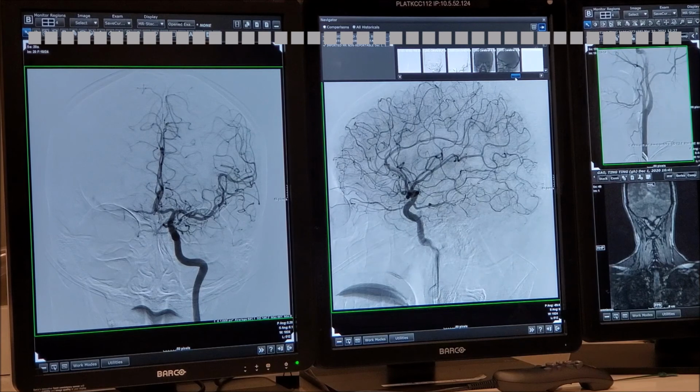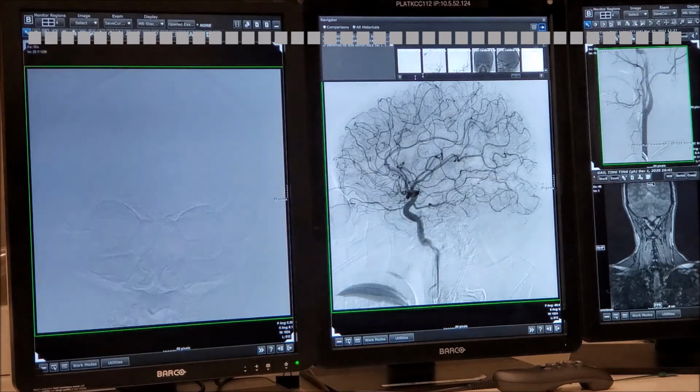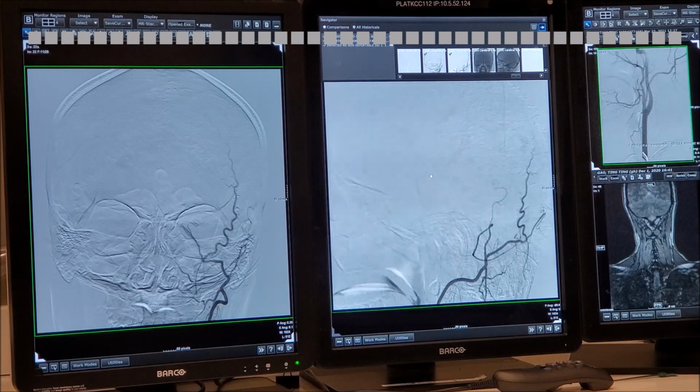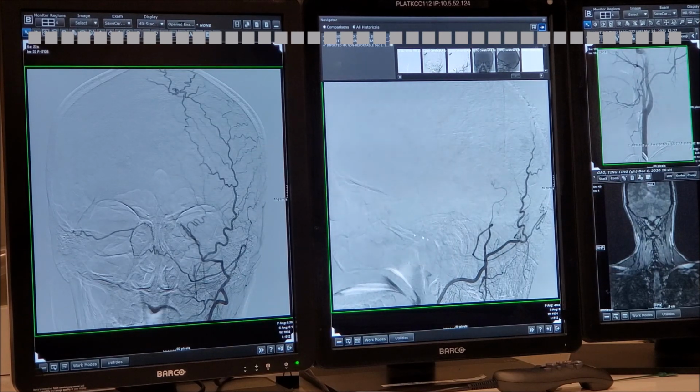Okay, and what else did you do? Here is the, very good. Okay, so you did this. Here's the occipital. Look how nice. Remember we talked about the transmastoid branch? This is a variation of that. How do I know that this is supplying an intraosseous blood vessel? Remember our principles. Not very tortuous. Oh, this is an unbelievable variant. Because I trace it back, I'm sure that this is a meningeal artery.